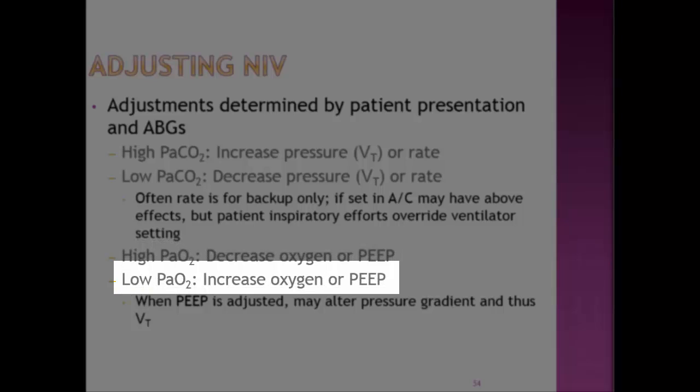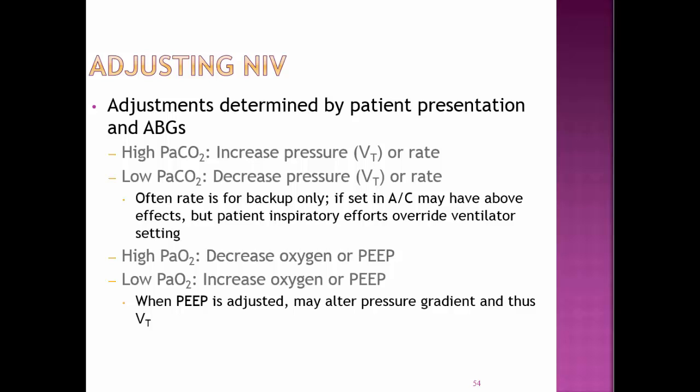If you have a low PaO2, increase the oxygen or the PEEP. And again, if you increase the PEEP and you don't increase the IPAP, then it's going to compromise your tidal volume because now your ventilation pressure is going to be less.